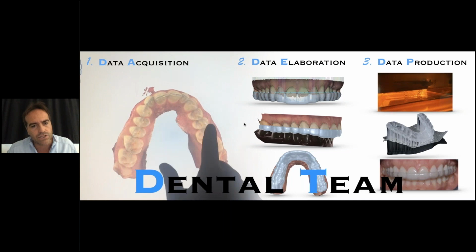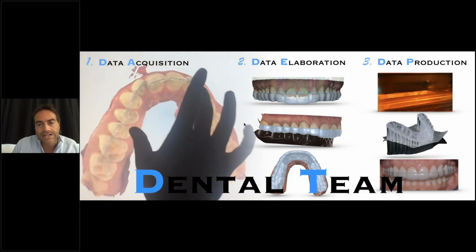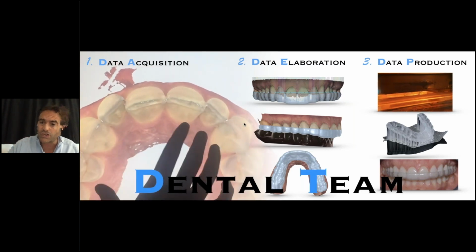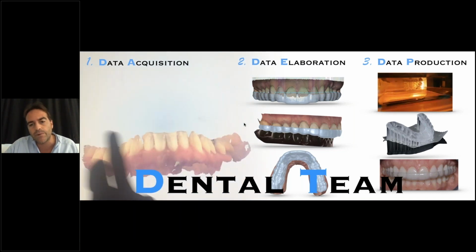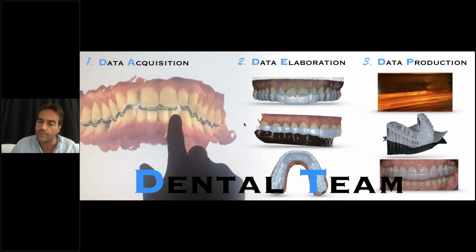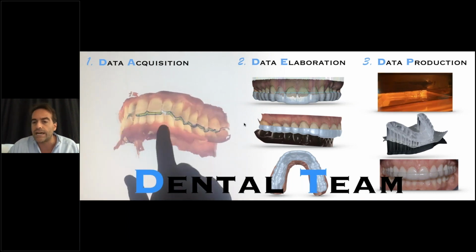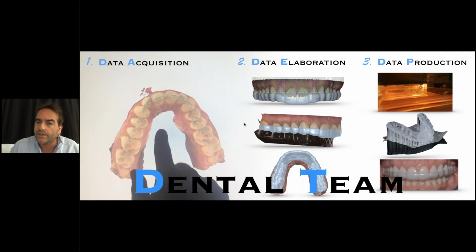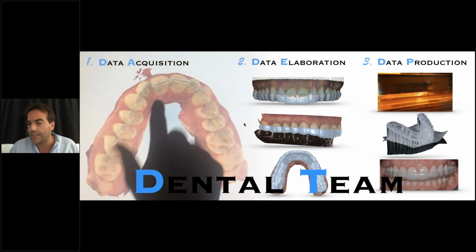That's the great advantage. And once we are happy with what we have acquired, we send all the files through the cloud to our lab technician, who is going to, through specific software, elaborate our files, creating a completely digital project, having all the major variables of the situation, in this case of the night guard, under control, which will then be produced and tested in the patient's mouth.